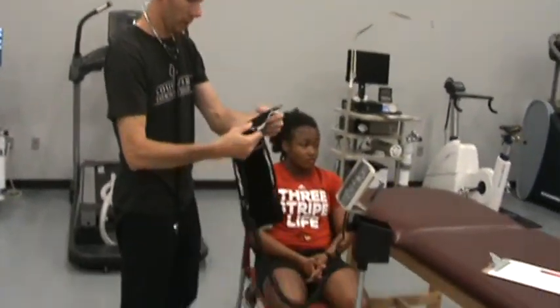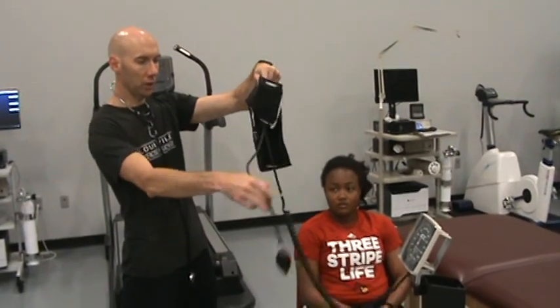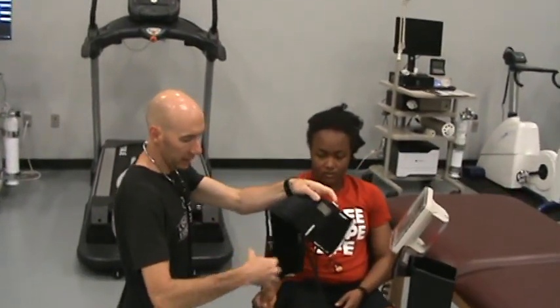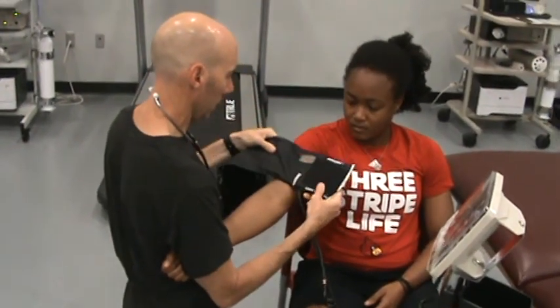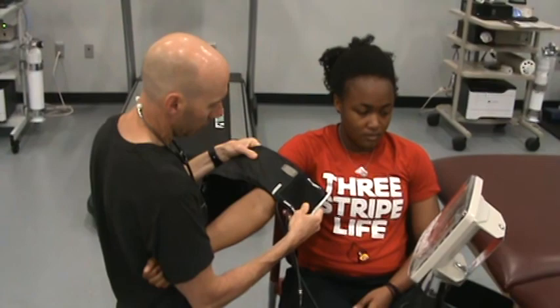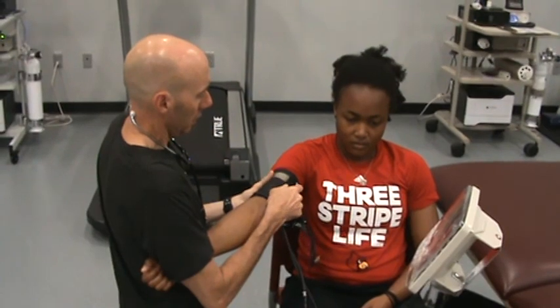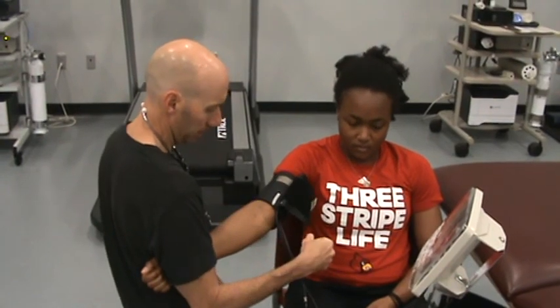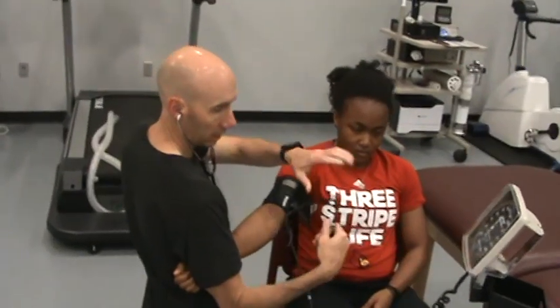I'm gonna position my cuff again. It's always good to make sure these tubes are all untwisted before you put the cuff on the individual. So what I'm gonna do is go ahead and just take Lindsay's arm and sort of clamp her wrist between my upper arm and my torso. Now it's supported to heart level. I can just keep it there. I'm gonna line up my artery mark again. You don't have to get this super tight when you're putting it on. You just wanna make sure it doesn't fall off. Okay, so that's placed correctly. Stethoscope. Again, I'm gonna make sure I can see the dial.